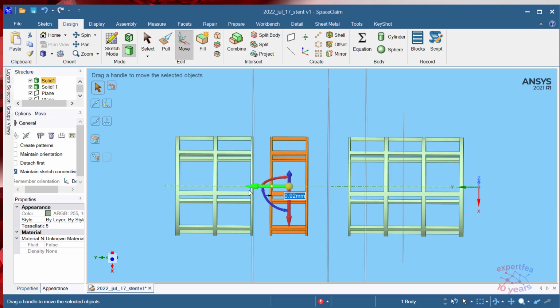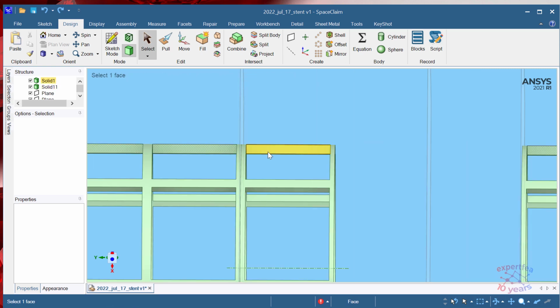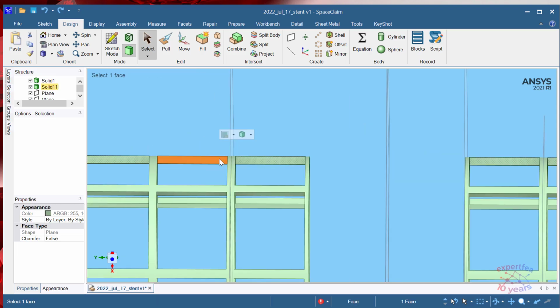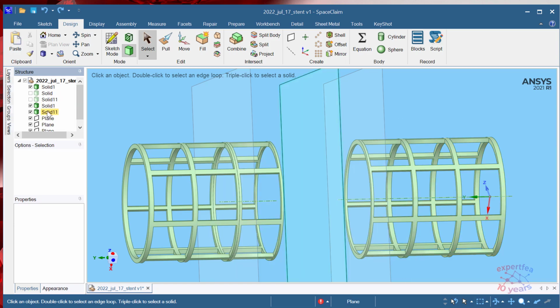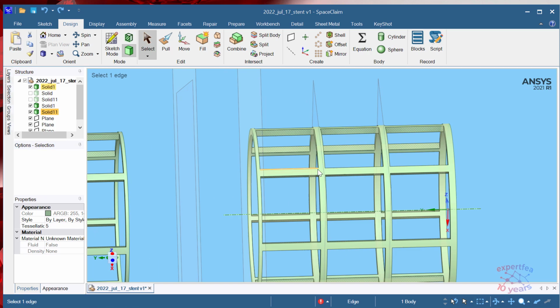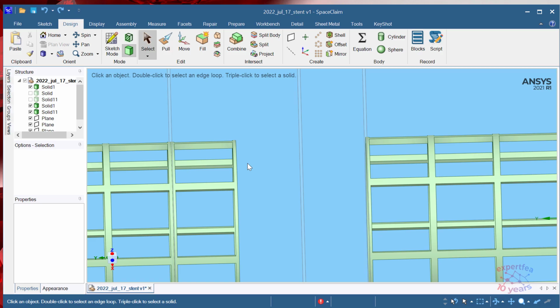Oh, it's dependent on the other side. Alright, I will triple click 1, 2, 3. Right click, make independent does not work. You see why? Maybe some time ago I said that I don't like having mirroring relationships and pattern relationships because they tend to stay. Right click, I'm looking for make independent. If someone sees this, of course it's not possible. 1, 2, 3. Make independent does not work. Alright.